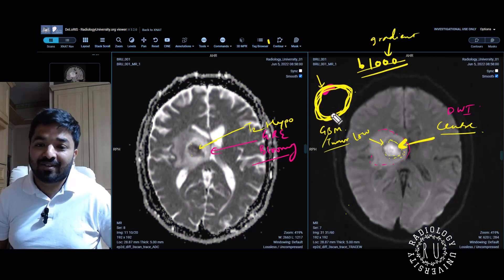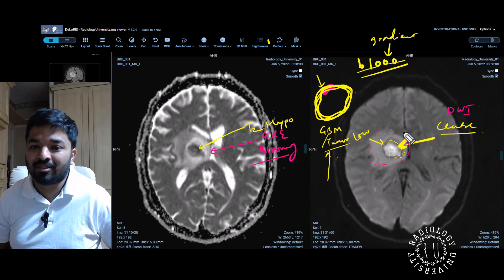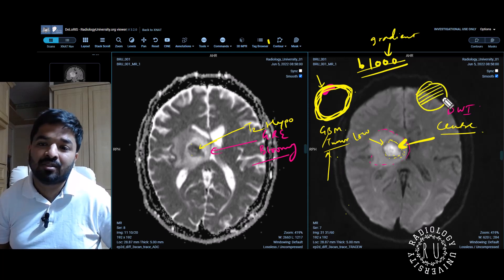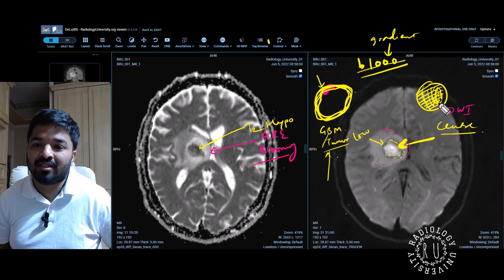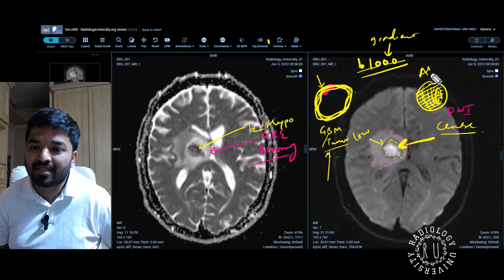For your exam: if something is showing diffusion restriction in the periphery, that is tumor. If something is showing diffusion restriction within — centrally — that is abscess.